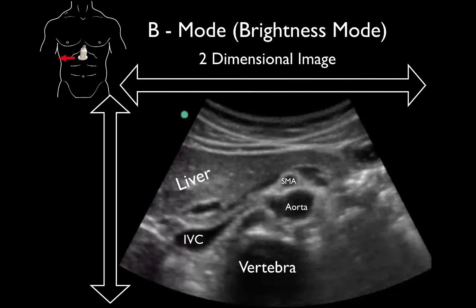In this case, we have the probe placed on the patient's anterior abdomen in the epigastric region, pointed toward the patient's right side. Let's identify some anatomy before we see a live video. We see the liver here. You can see a little bit of the portal system and splenic vein coming across. Deep to that we have the IVC, then the SMA, and deep to the SMA is the aorta. Deep to that we see the vertebral body.